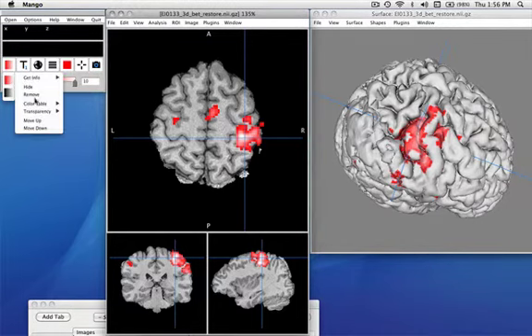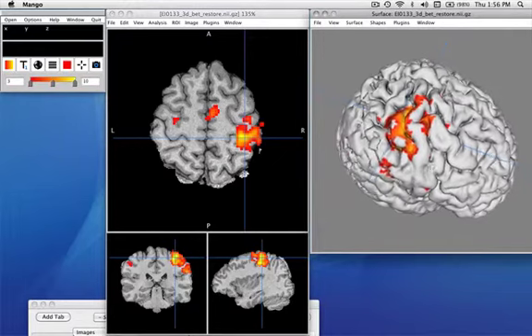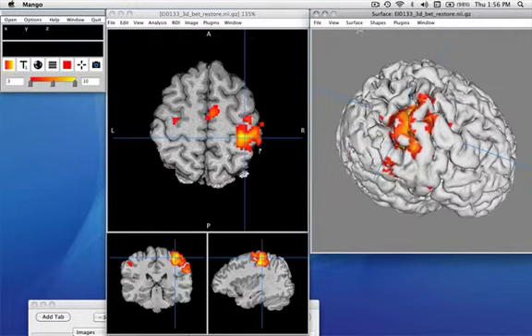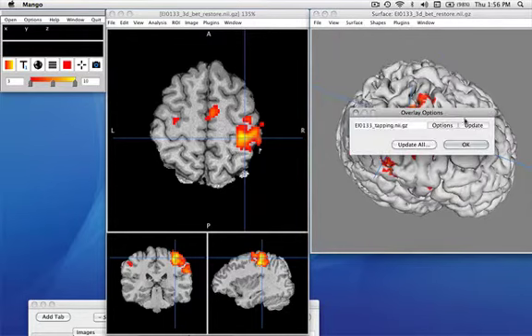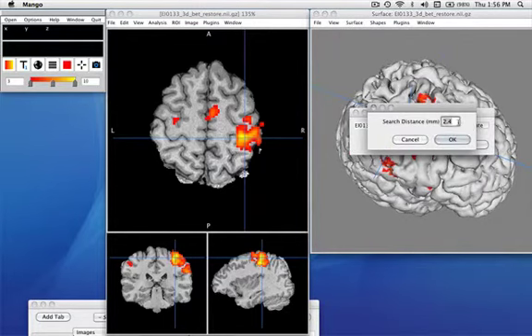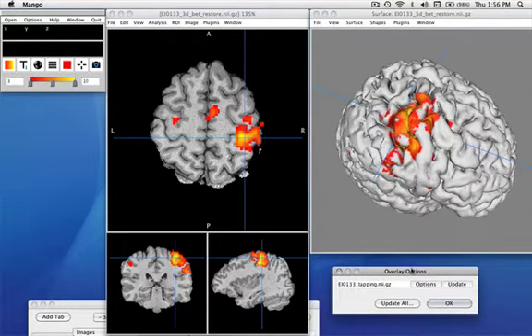You can change the color table that you use with the overlay. You can also change, under the surface settings, how far from the surface you'll map things. Presently we're not very far away, but we might change this to maybe 5 millimeters, and you can see it maps up a little bit more.